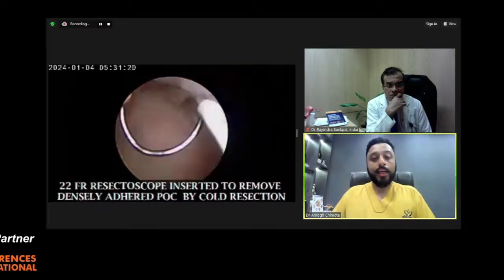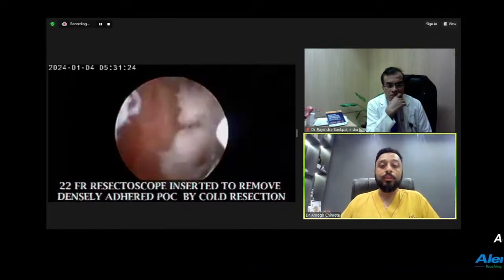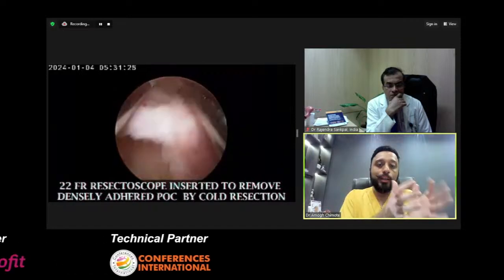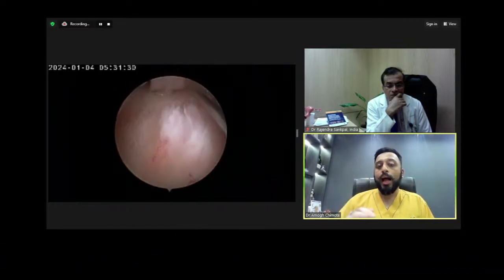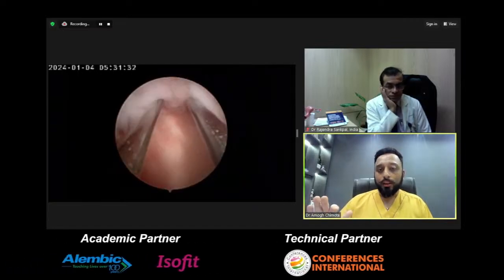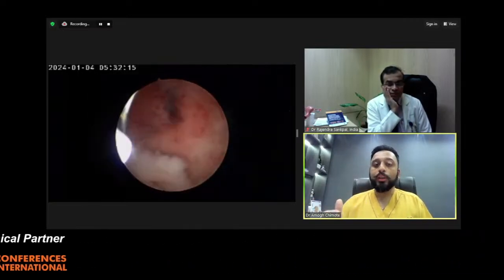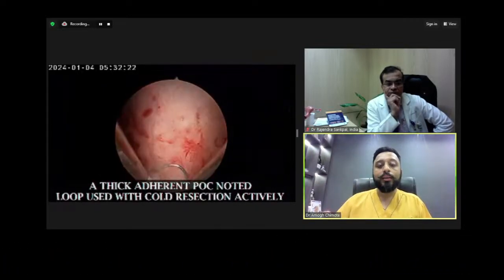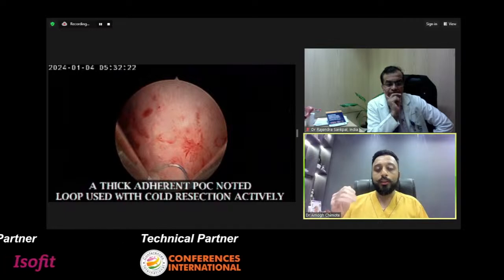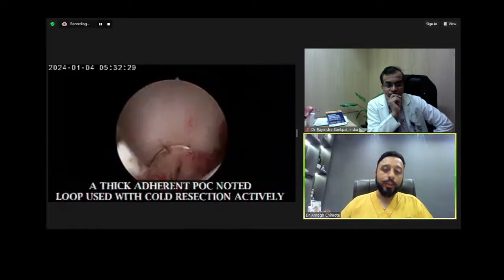The scan of this patient showed that she had adenomyosis, and this implantation was on that adenomyoma, and hence the residue was densely adherent. Here I am not using any energy, even though it's a bipolar resectoscope. As you can see here, this was the point where it was densely adhered and very thick. It was difficult to cut with scissors and it would have taken a very long time.